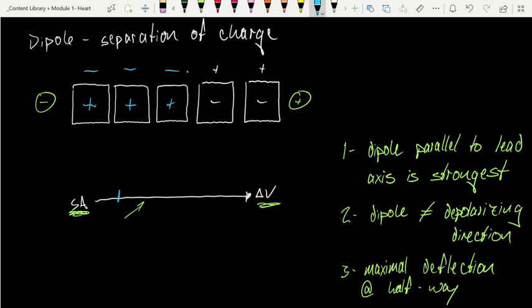So if I was drawing, because this represents the SA node to the AV node, this is my P wave, what have I seen? I started at 0. I started my positive deflection, but now I've reached the peak. Of course, when the next one fires, I'm past halfway, so it's not as strong of a deflection. I'm starting to come down. And of course, now everything has depolarized. There's negatives on the outside all across the board. There's no more dipole. So where do I find myself? I find myself back at baseline, back at 0, no deflection. We've just created the P wave.